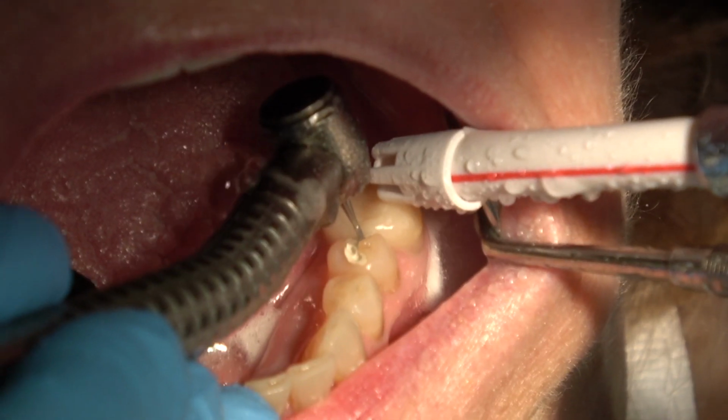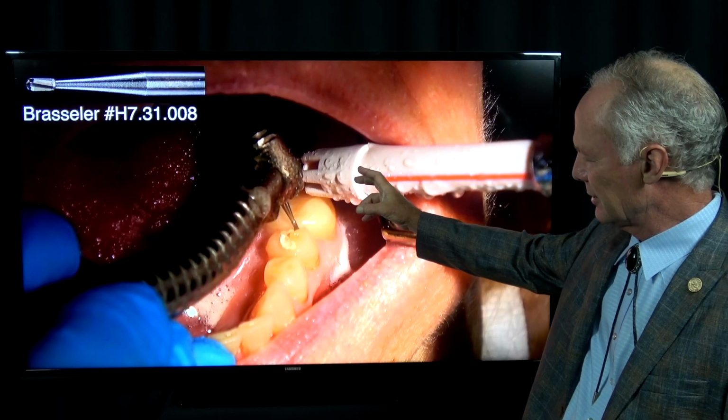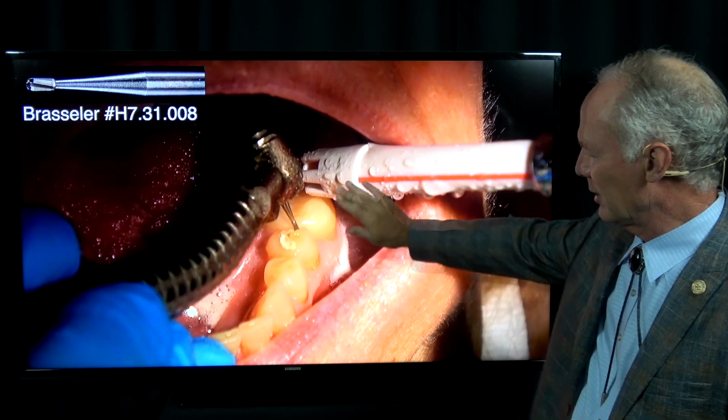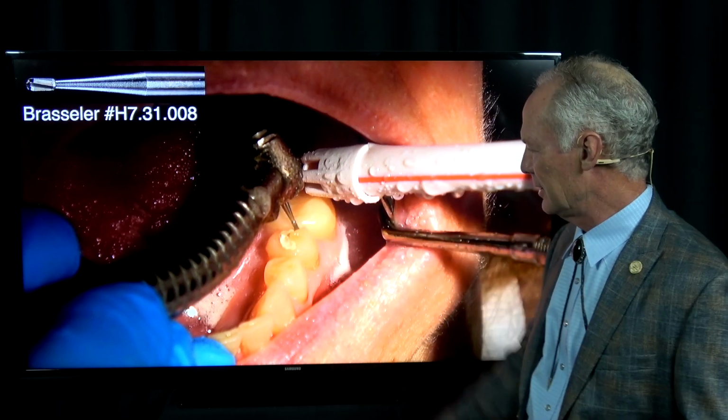So if the patient were to lose this provisional restoration, mesial drift might cause the tooth posterior to it to drift just a little bit. So you want that provisional restoration to be in tight contact with the adjacent tooth.